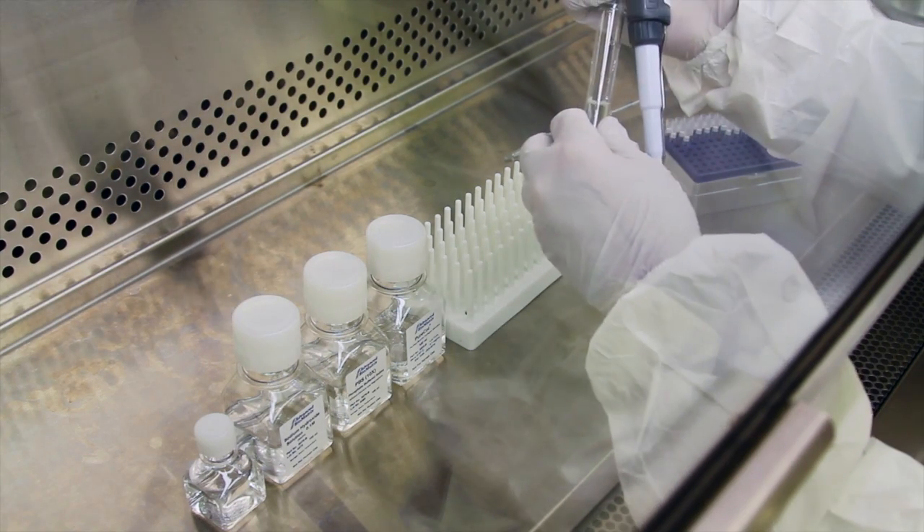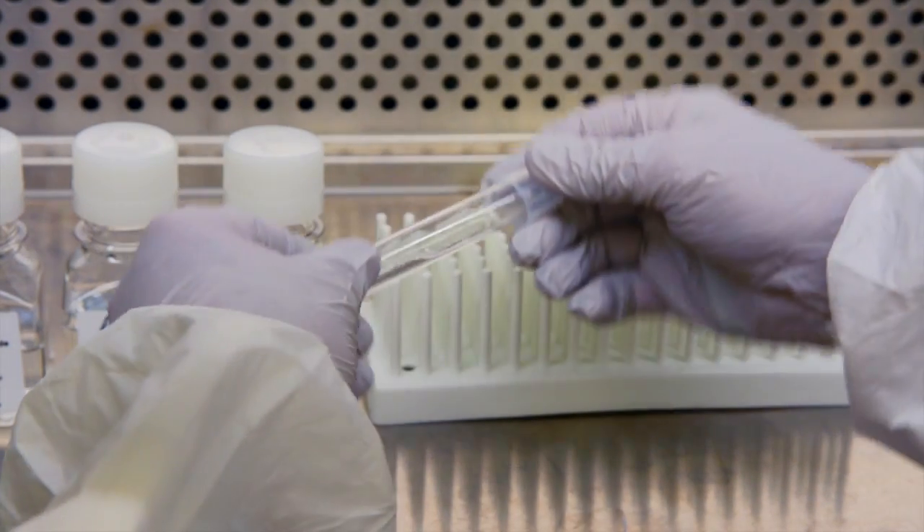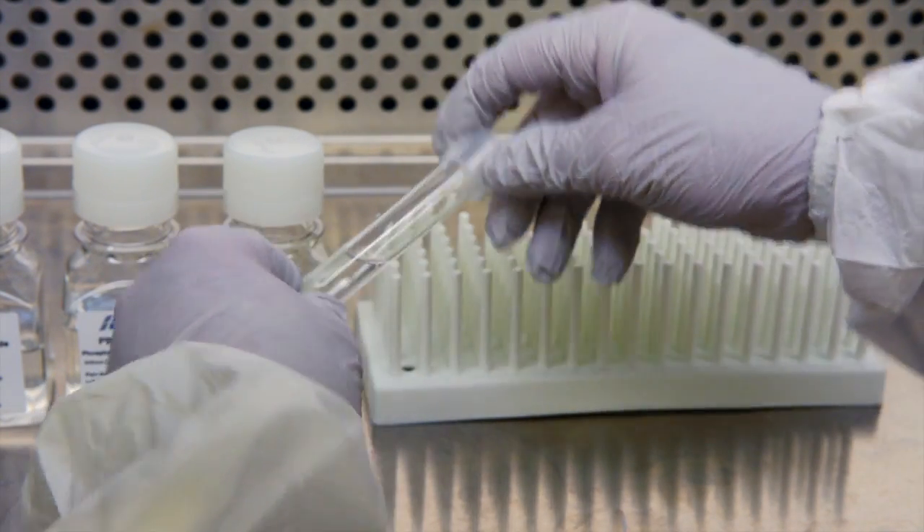Immediately cap the test tube and gently mix. Do not vortex the mixture. You may see a slight amount of white flocculant in the mixture — this will go away shortly.